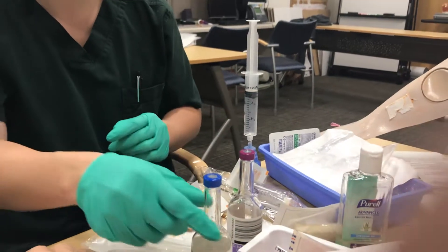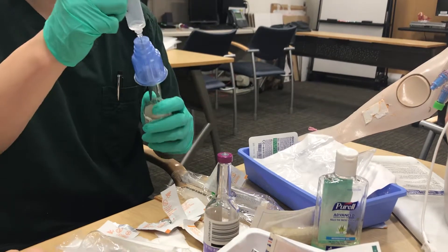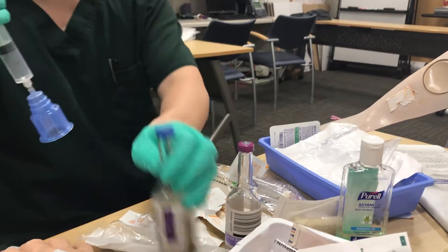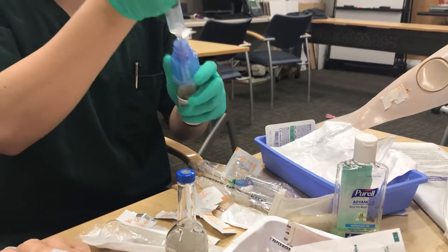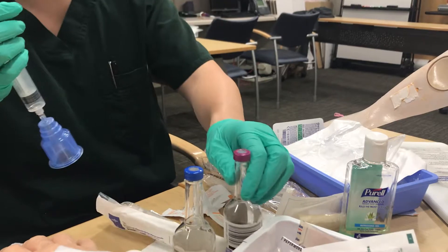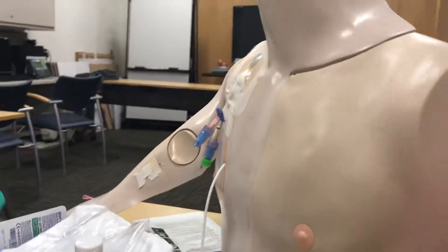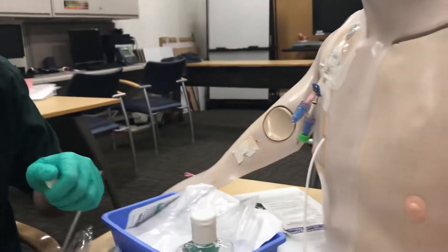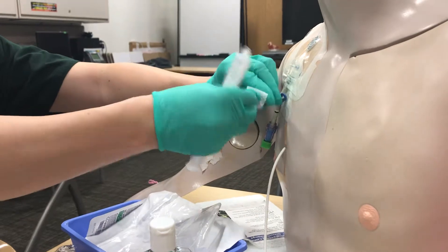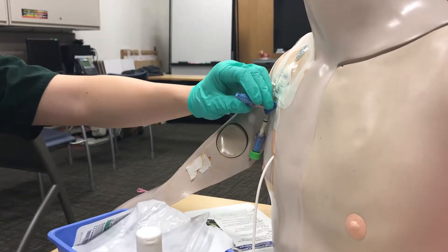Similar to the peripheral process, you always want to do your aerobic first with 10 cc's, then the second bottle with the rest of it. After that, go ahead and flush the line and give it a good alcohol swab, then allow it to dry.